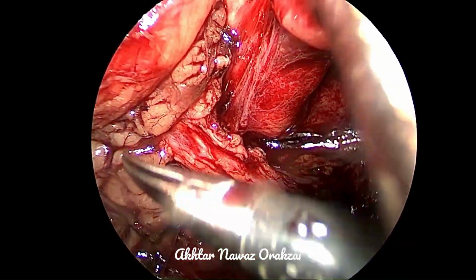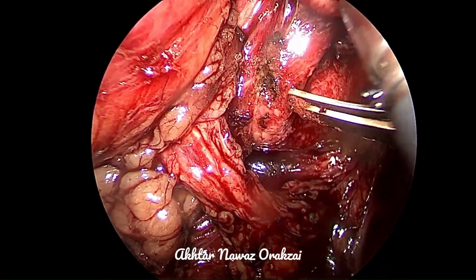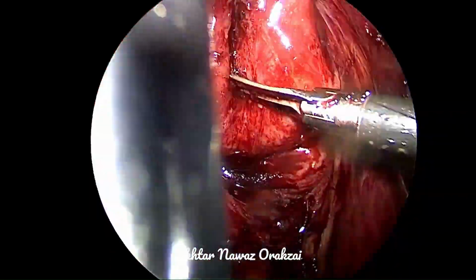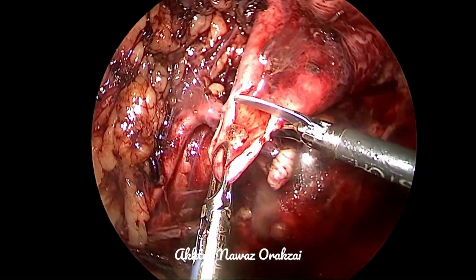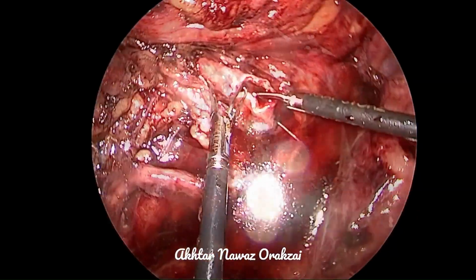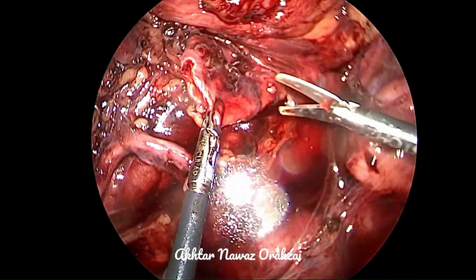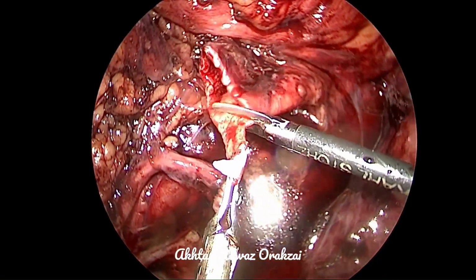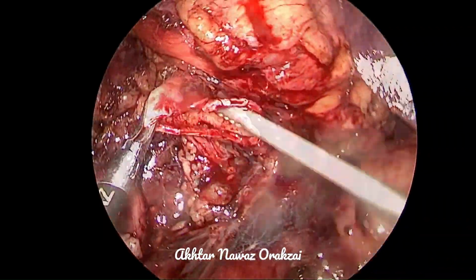Mobilization of this portion of the pelvis is of utmost importance, because the more we mobilize it, the more it will go away from the vessels, and tension will also be released. Then the anastomosis can be performed without tension. Here you can see that I am not cutting the inferior segment of the pelvis, and we have excised. So we excise a little more just to reduce, but however you can see I am cutting again the area from the upper portion of the pelvis and leaving the lower segment behind.